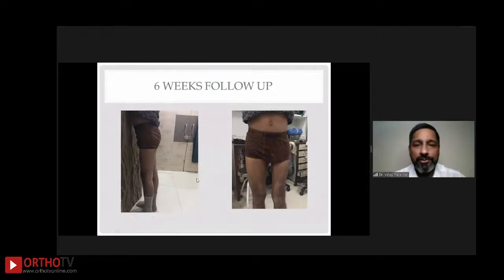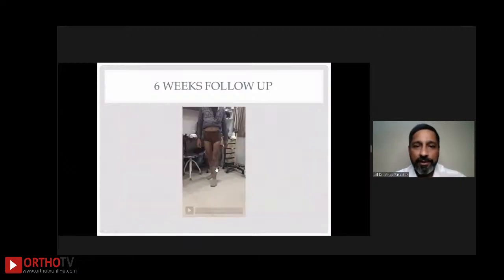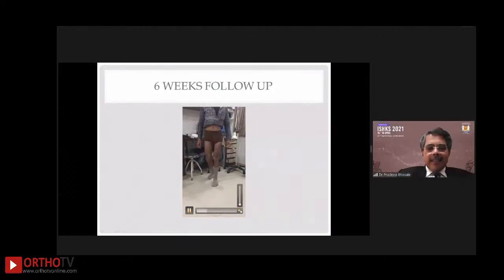It looks much better. So just wanted to show this. This is at 6 weeks. Yes, he's pretty comfortable. And I just chose not to give him a shoe raise here, just to see what his actual gait is in this. I think it's corrected quite well. Yeah, it was an apparent shortening.